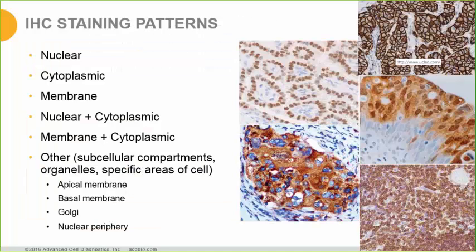Some of the common IHC staining patterns are shown in these images and listed here, including nuclear, cytoplasmic, membranous, nuclear and cytoplasmic, and membrane and cytoplasmic staining. Other staining patterns are also possible, but less commonly seen, including specific staining of subcellular compartments, organelles, and other specific areas of the cell.